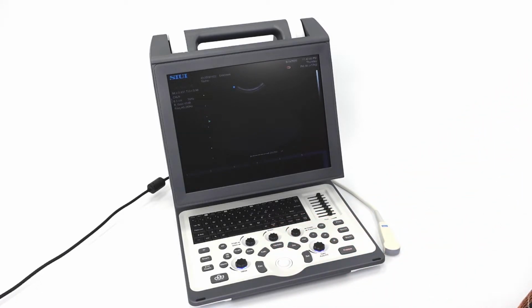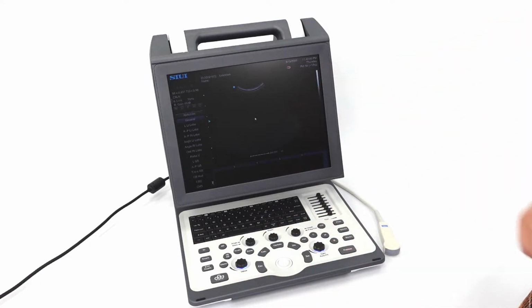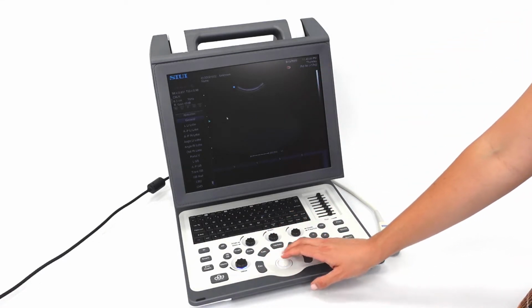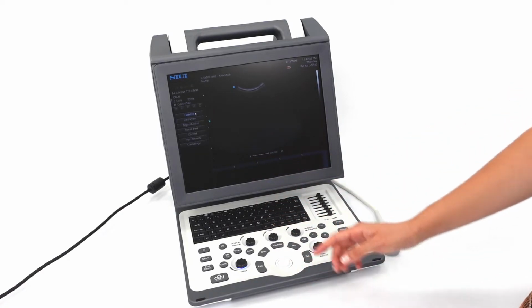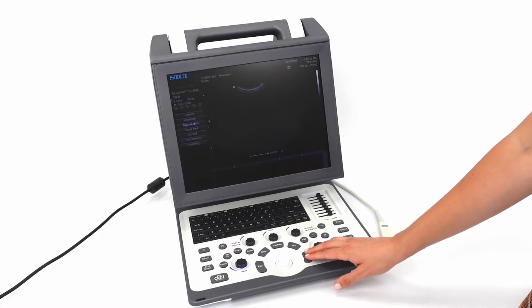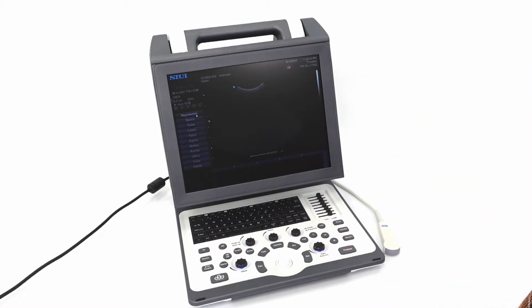To perform gestational age calculations using the Apogee 2300, freeze your image, press Calc. If you're in the general abdominal mode, you'll have to navigate to find reproductive. So move your mouse over abdomen, press Set, and you can then find reproduction here. You've got a whole range of species to choose from.